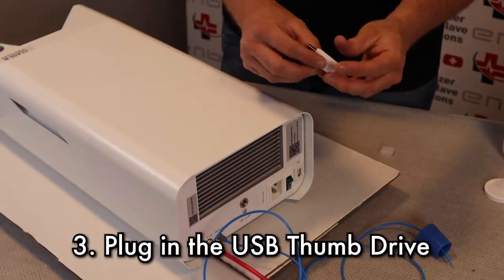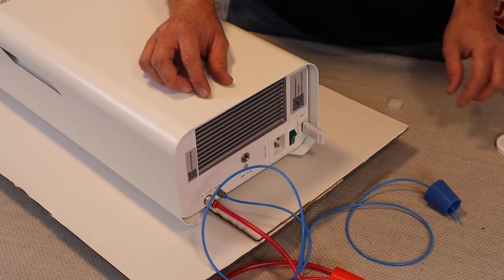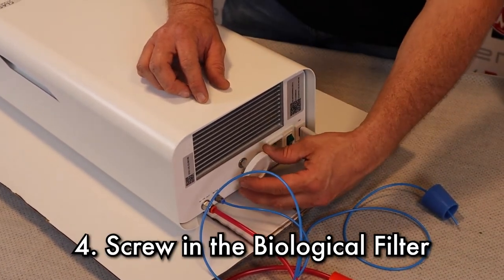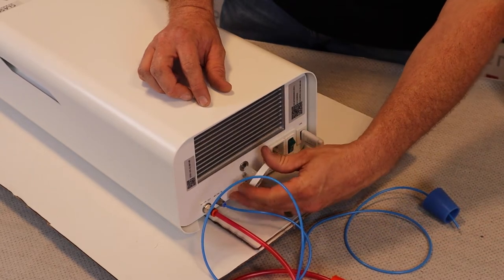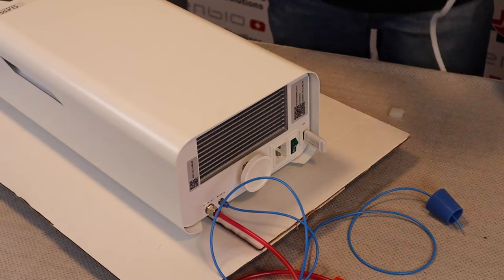There is a USB thumb drive. This needs to be inserted before turning the unit on. And the biofilter — the biofilter will spin approximately seven times into place. You want to make sure you have it lined up straight so it does not cross thread. Once that is in, we are going to plug in the unit.